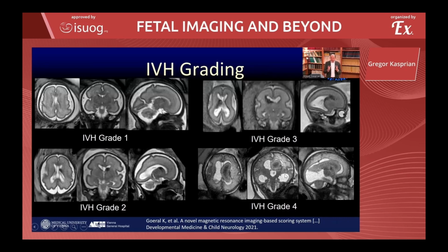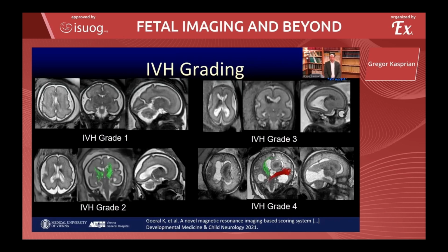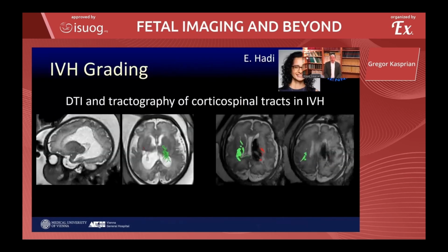However, this is a simple approach to the problem. We do not currently respect if major pathways, functional aspects of the brain are involved or not. And that is and has always been a job for neuroradiologists to bring together the structural and the functional aspect.